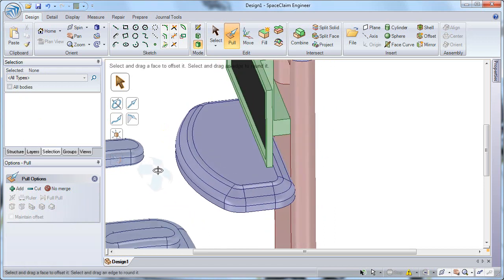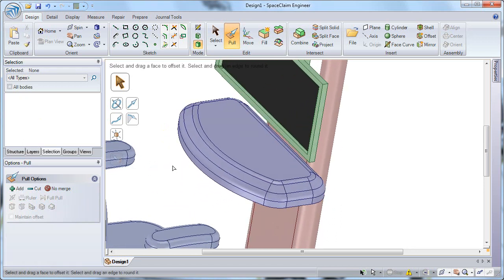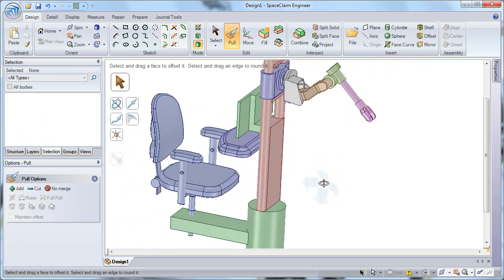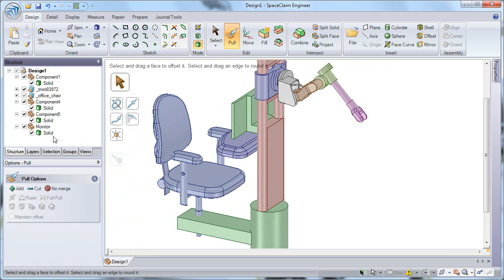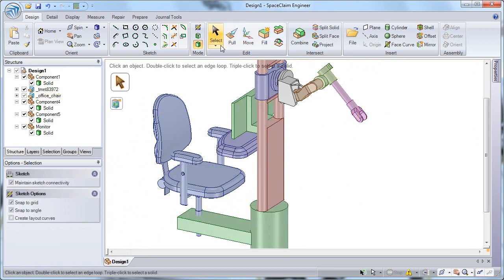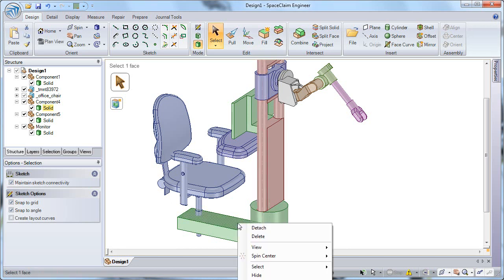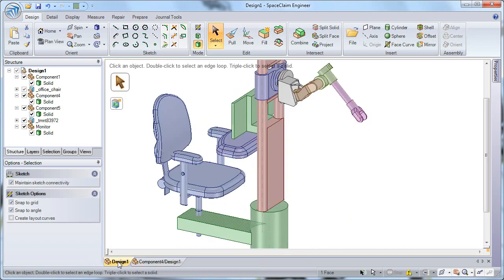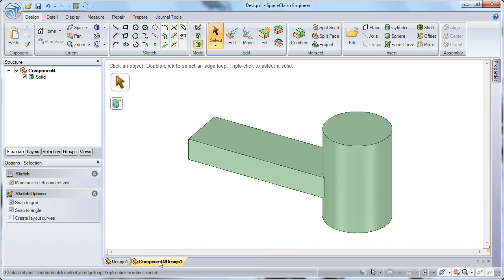And that completes our design of our table for that medical cart. So the last part that I'd like to feature a little bit more is our base part. So let's right click on our base component and choose Open Component to open that in a separate tab. And we can tab between our two designs, but we can work on this base separately.